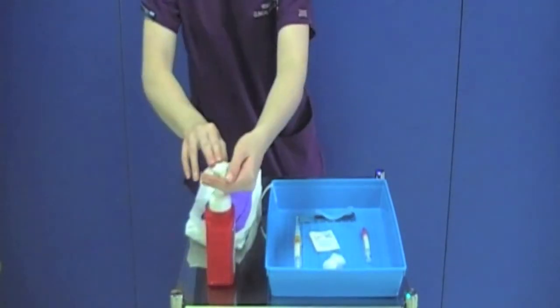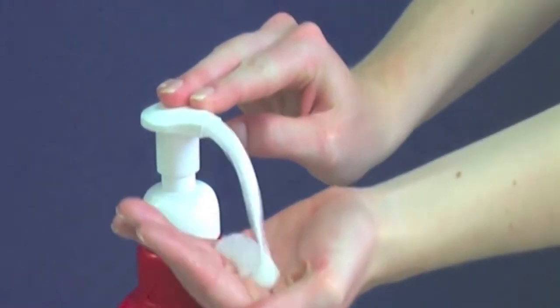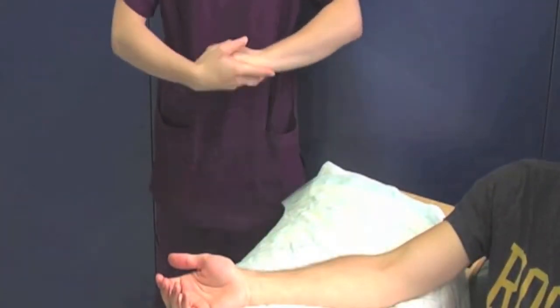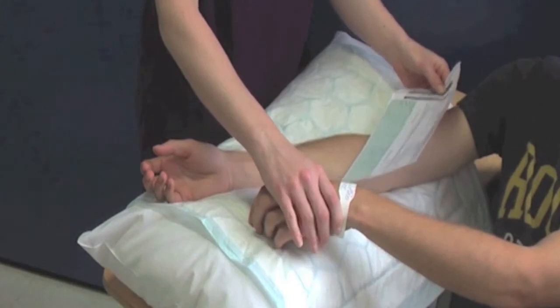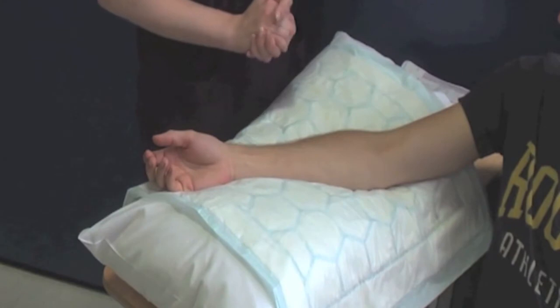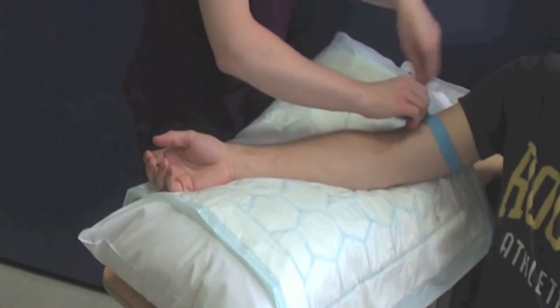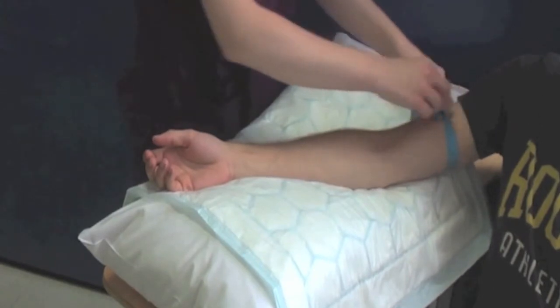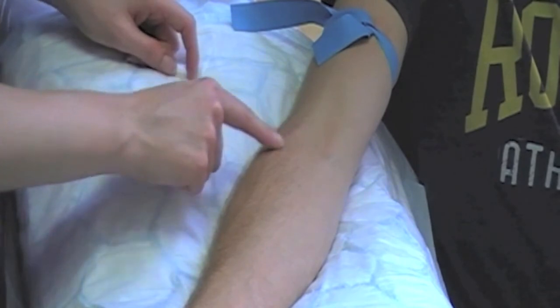Decontaminate your hands and proceed directly to your patient. Once you are at the patient's side, decontaminate your hands again. Reconfirm the patient's identity against the blood request form and confirm that the patient is happy for you to proceed. Position the patient so that they are comfortable and ensure your equipment and sharps bin are within easy reach. Apply a disposable tourniquet to the patient's arm and palpate for a suitable vein. Once you have located the vein, release the tourniquet until just before you perform the procedure.